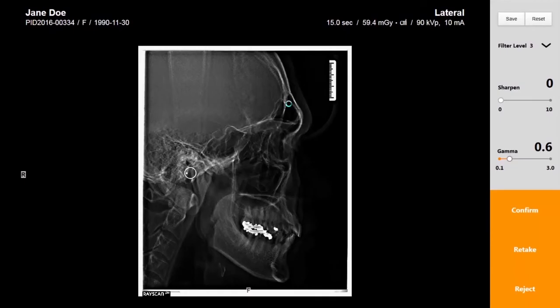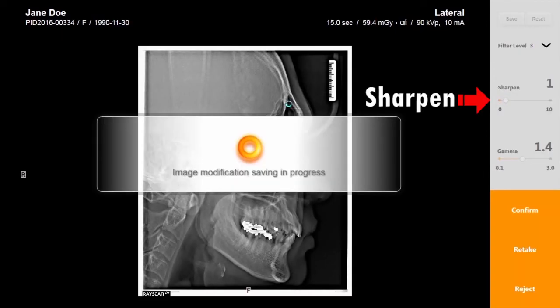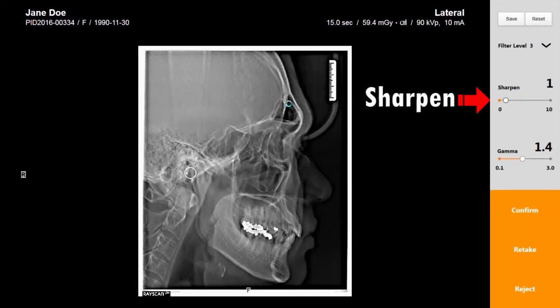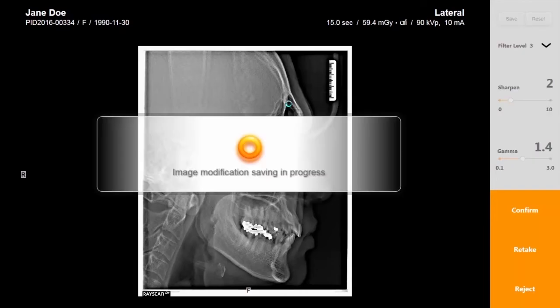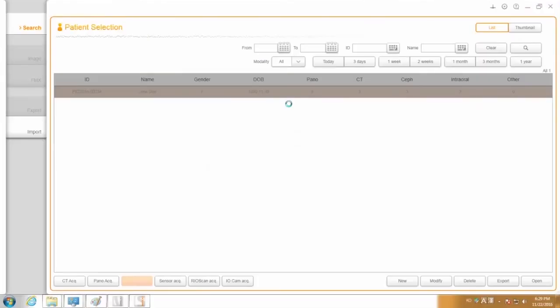After image acquisition, make any desired optimal image adjustments by adjusting the sharpen or gamma value. Click the confirm button to save the image.